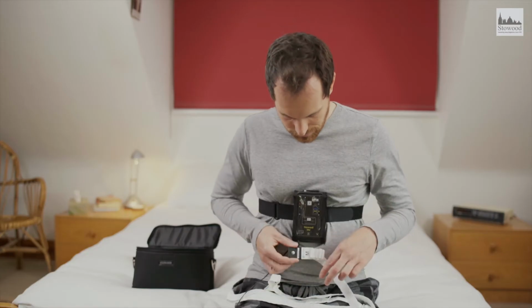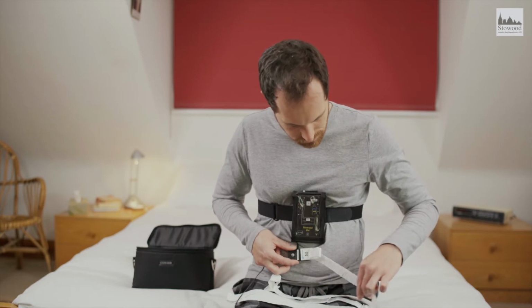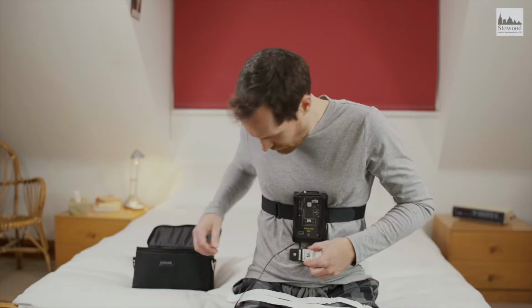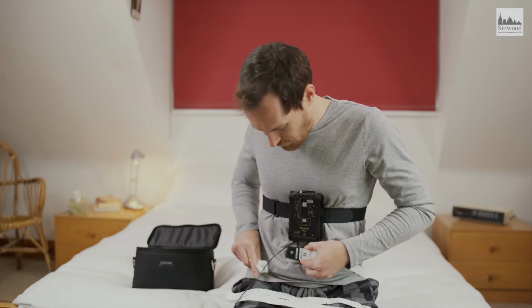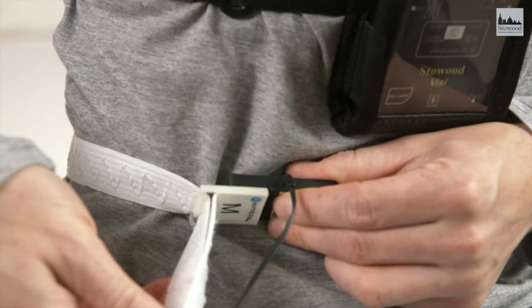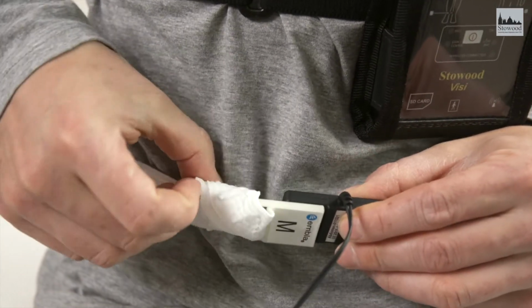Hold the sensor against the abdomen in one hand and use the other hand to bring the band around your body. Then, snap the band onto the other side of the sensor. Pull on the loop to tighten and then tuck the loop behind the band out of the way.